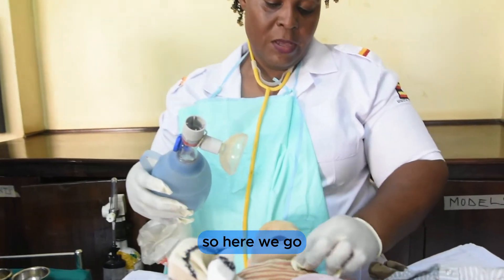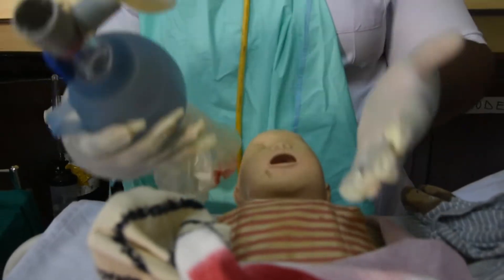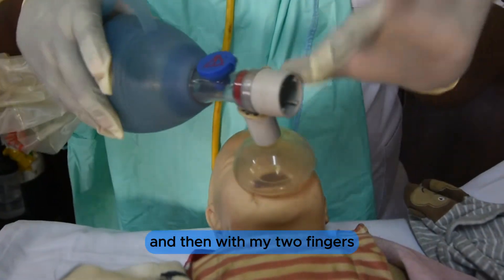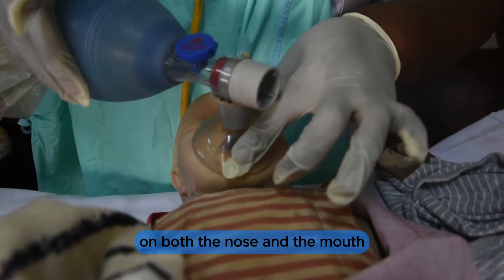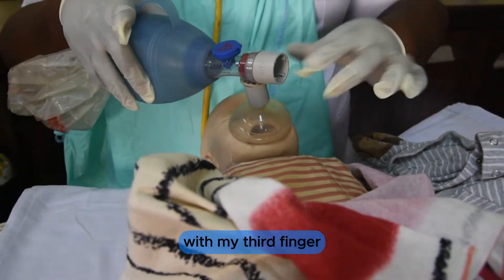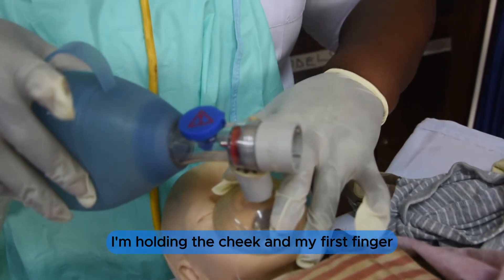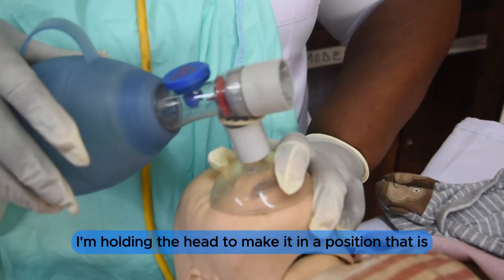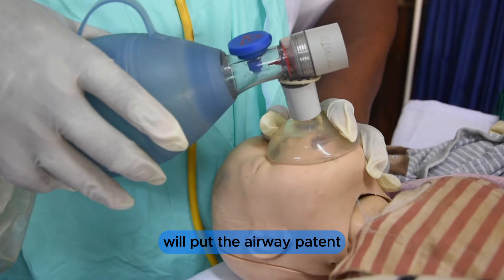We expose the baby's chest. The head must be straight. With my two fingers I hold the mask tight over both the nose and the mouth. With my third and fourth fingers I hold the cheek, and with my first finger I hold the head, positioning the airway correctly.